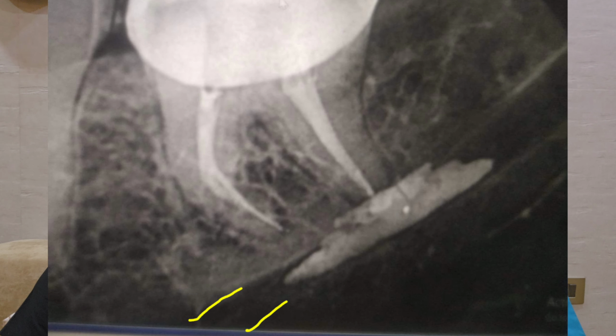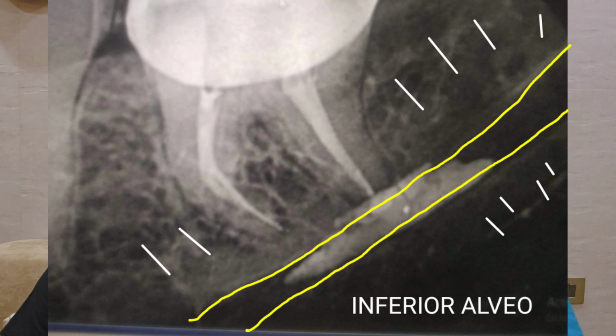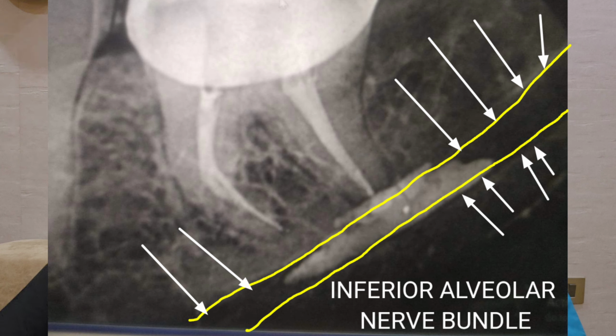It is extruded beyond that, and what happens is, like we mentioned in the last video, there are many important vital anatomical structures, like the nerve which supplies the lip and the tongue and this area on each side underneath the molars, like in this tooth. So what has happened is that this material has been pushed beyond the tip of the root due to excessive pressure, and that has now gone very close to that nerve, or in that nerve space.